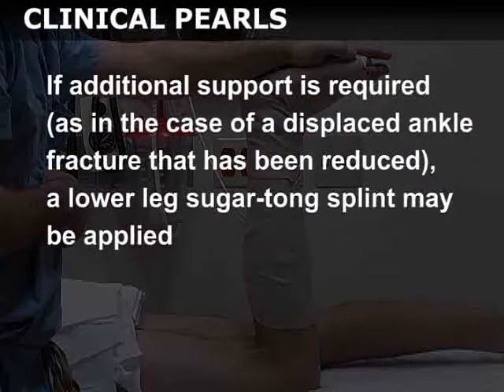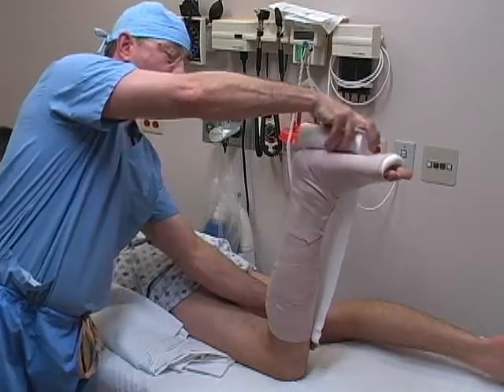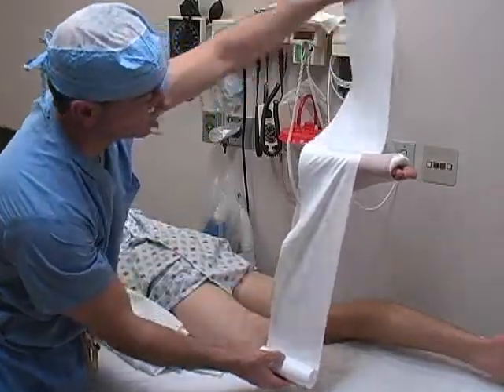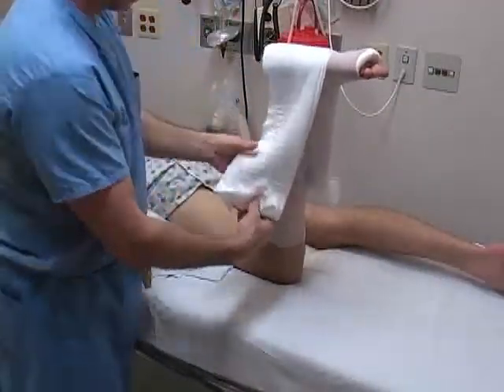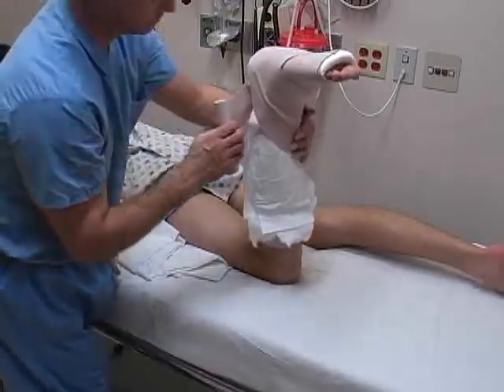If additional support is required, as in the case of a displaced ankle fracture that has been reduced in a closed fashion, a lower leg sugar tongue splint may be applied in addition to the short leg splint. To apply the sugar tongue, first measure from the medial portion of the lower leg, around the foot, to the lateral side distal to the fibular head. Prepare the cast padding and plaster as described above, again using about 12 layers of 4- or 6-inch plaster. Apply the splint in a stirrup fashion around the ankle and secure it to the leg using elastic bandage applied in a distal to proximal fashion.